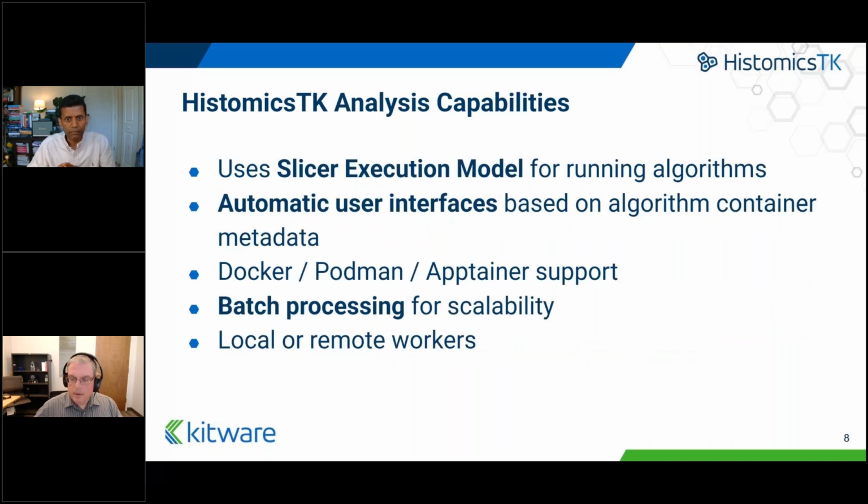The first step in any project is to look at your data, then analyze it. We use containerized plugins that conform to the Kitware Slicer3D execution model. A user interface is automatically produced for each plugin based on its metadata. These plugins can operate on simple file inputs or integrate directly into HistomicsTK to manipulate annotations and meta information.